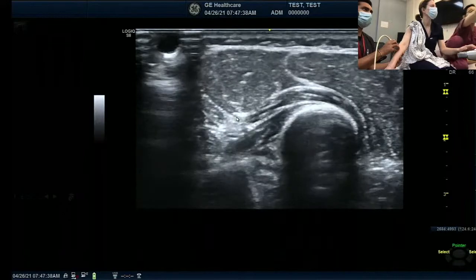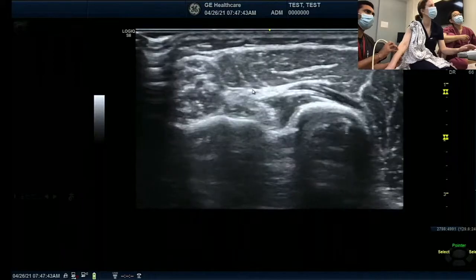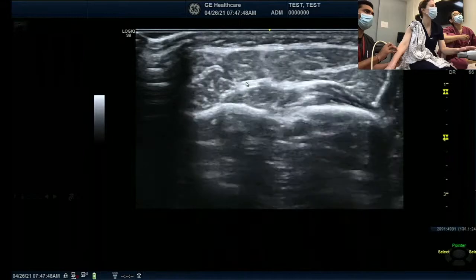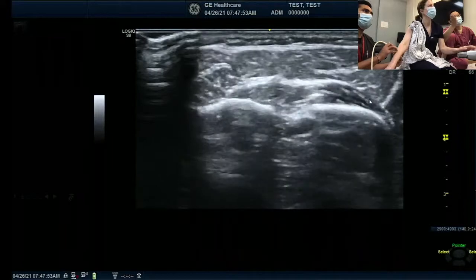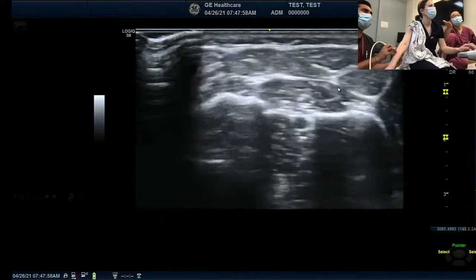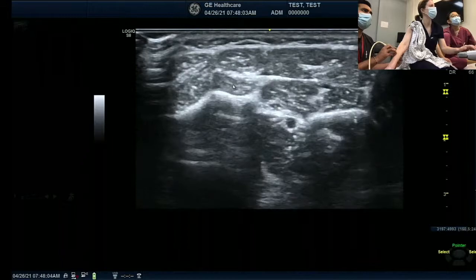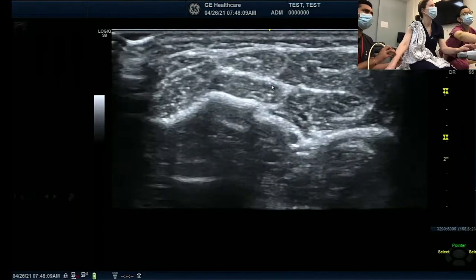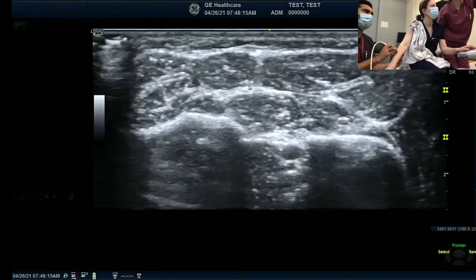You have to make the EDC a square shape. See, now it becomes square. The radial nerve is exiting, right? That's the supinator going away. You can see it going away, almost gone, going distally, still gone. Now the EPL popped out already. Keep this one. The deep branch is not easy in every case, but here you can see it.